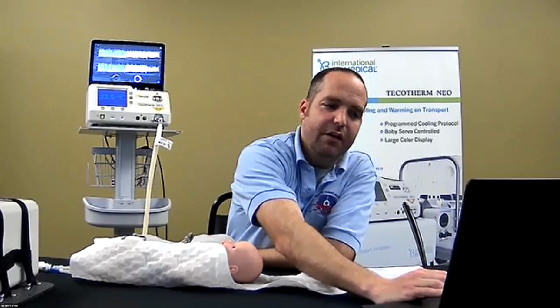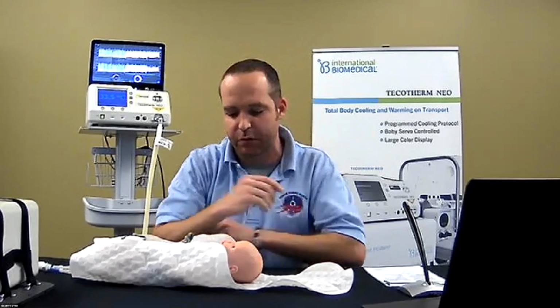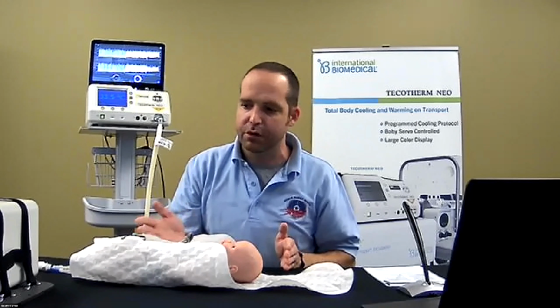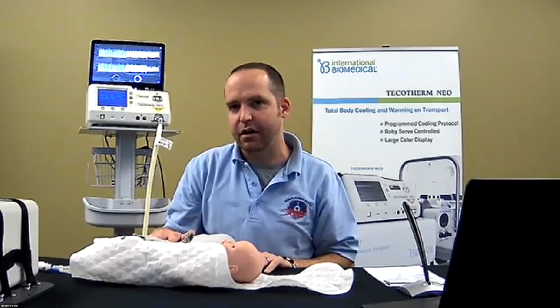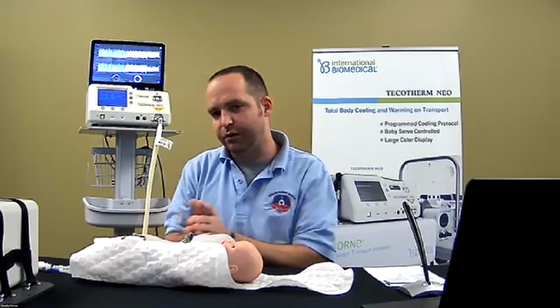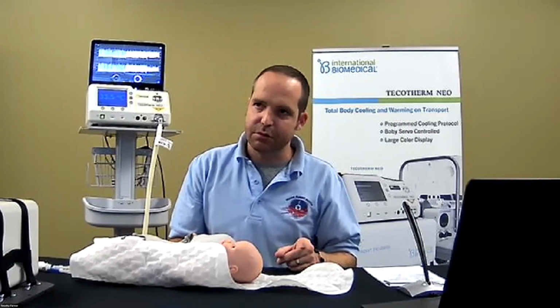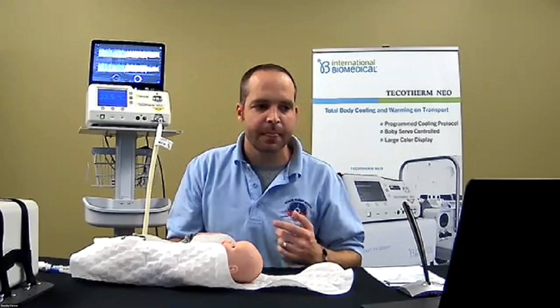During transport, we noticed that some things we were initially concerned about turned out not to be much of an issue. When we transfer from one power source to another, there is a brief disconnection in power, which will shut the Tecotherm off. But being able to maintain that constant mattress temp mode while going from a hospital to an ambulance, or from your ambulance to your rotor, even that space in between losing power wasn't enough to show any significant difference in our patients as far as the skin temp and the rectal temp measured.